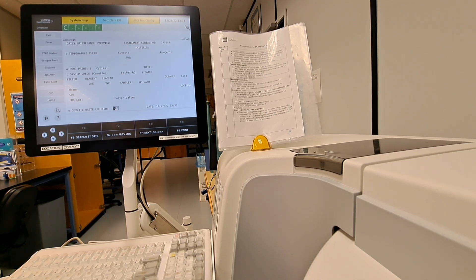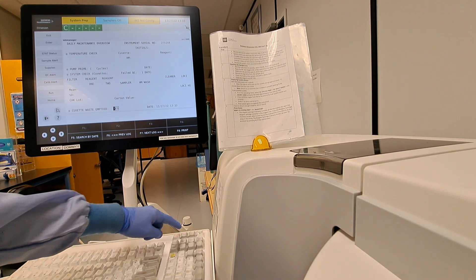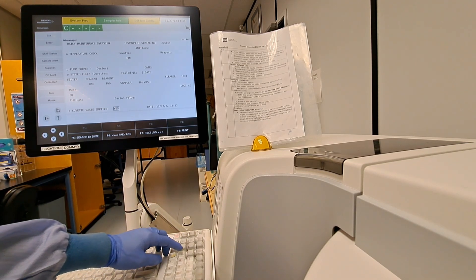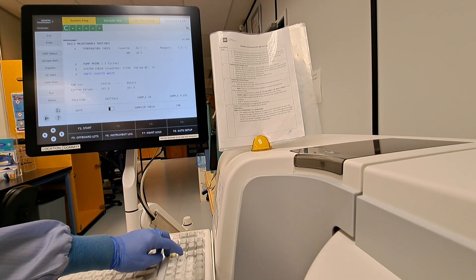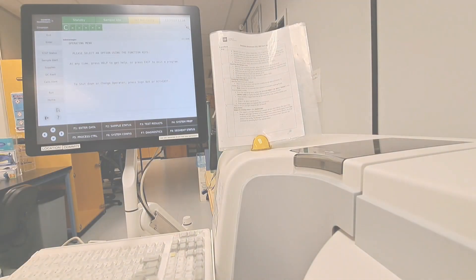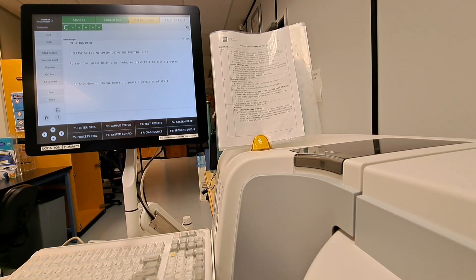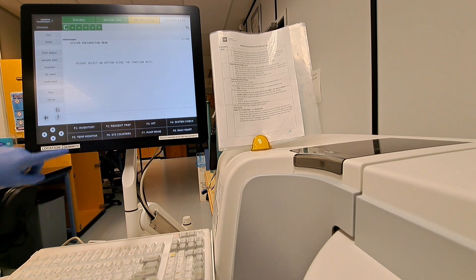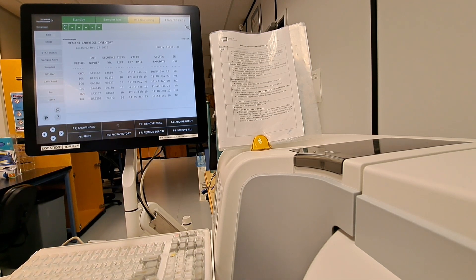From here, we can unpause the analyzer by hitting the pause button once more. Hitting exit on the keyboard allows us to return one screen at a time, whereas hitting home brings you right to the home screen. Checking inventory is an easy process on the EXL. From the home screen, we'll go to F4, system prep, then F1, inventory. Here we can see the test method, the lot number, and how many tests remain on that cartridge.